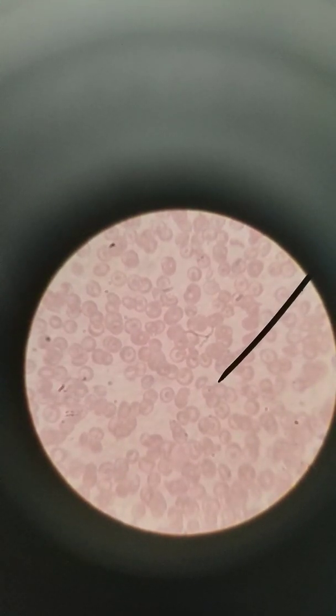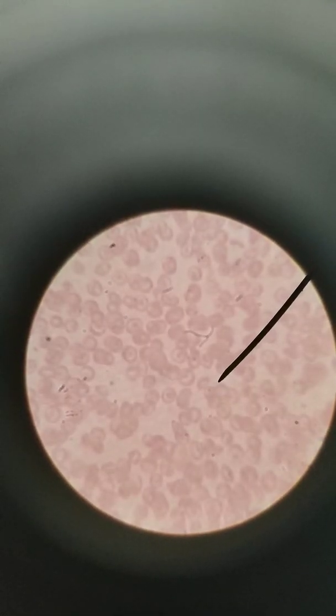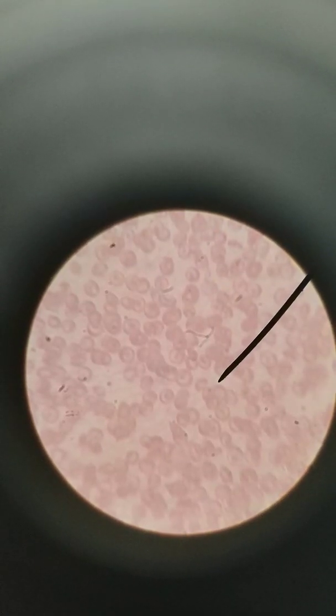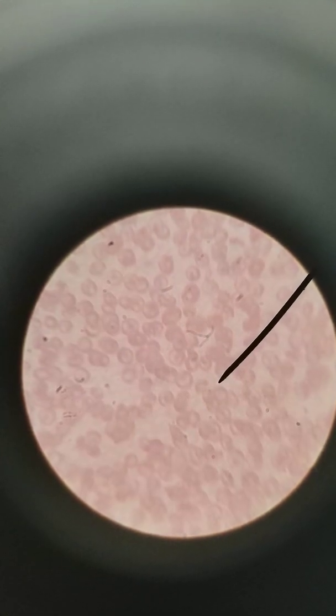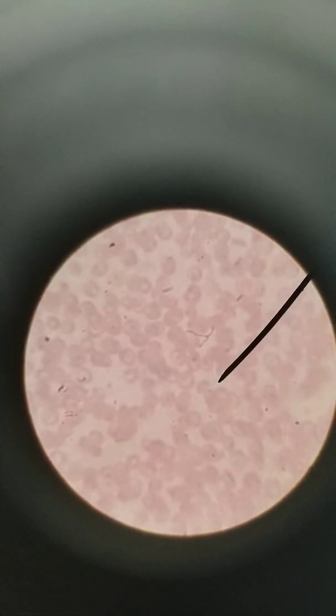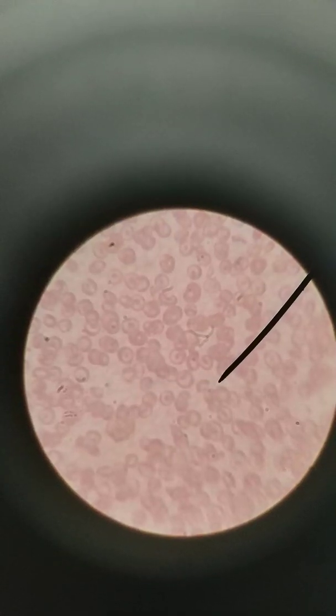This is sickle-cell anemia. This slide is of sickle-cell anemia. The cells are misshapen. They're sickled because of a mutation in hemoglobin. And if you have misshapen cells, your spleen interprets these as damaged and you start destroying these at a high rate. Also this has potential to clog up capillaries, which of course is never a good thing.